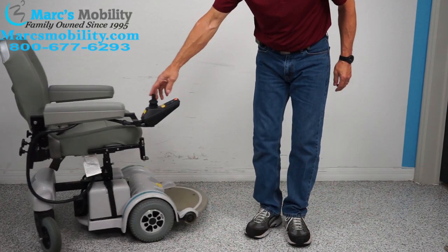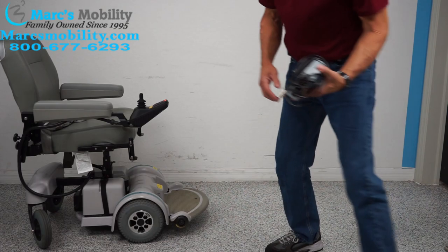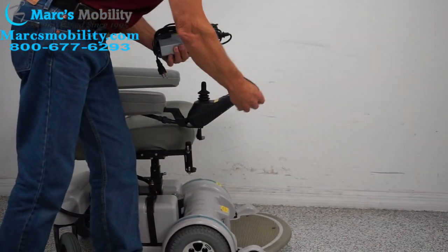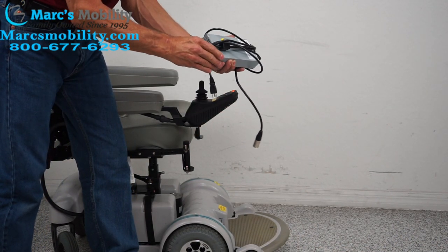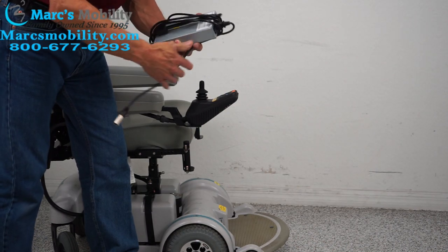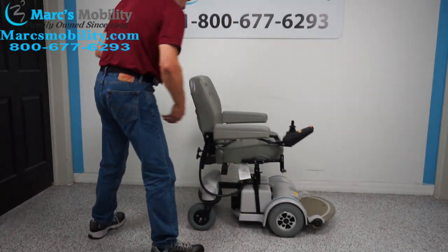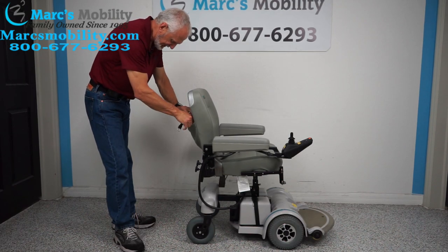Before we recap, let's talk about charging the chair. You'll take your Hoveraround charger and plug it right below your joystick. As soon as the light on your Hoveraround charger goes to green, the charger will stop charging. I'm going to put the charger right back here so we don't lose it — it'll be back there when we do the video outside.